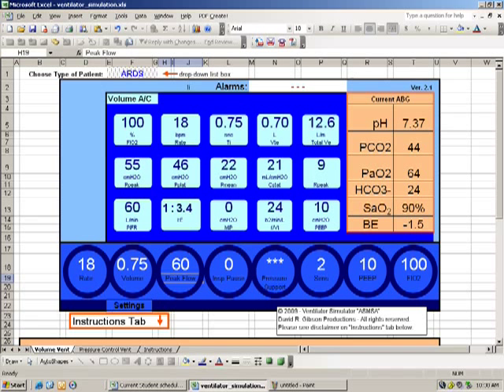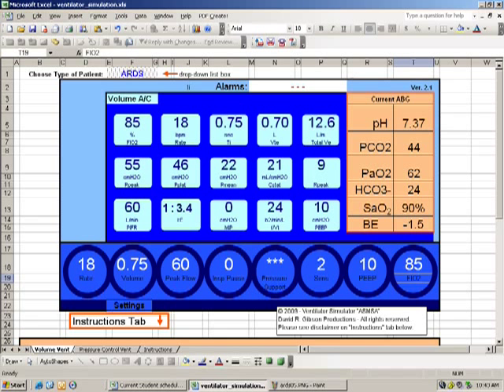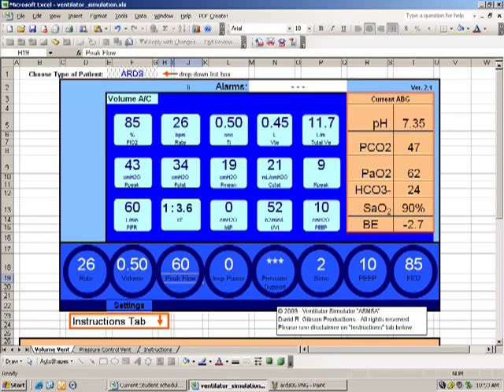And after playing around with different things, they realized really the only two things that had any effect on it were the volume, because that's the pressure that's exerted when the volume's pumped in the lungs and held there, and the PEEP. But first, the students felt a need to wean the patient off toxic level of oxygen and wean the patient to 85%. And that was a good move since it maintained the same SAT of 90%. Leaving the PEEP where it was, the students decided to lower the tidal volume, and it turned out that a tidal volume of 500, dropping it from 750 to 500, had good success in lowering the plateau pressure below 34. However, the patient became acidotic, and they were able to turn the rate up to 26. When they tried 28, I think mean airway pressure went up high enough that the patient became hypotensive, without much change in CO2. So they decided on a CO2 of 47 at a rate of 26.